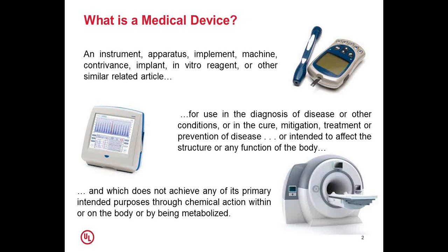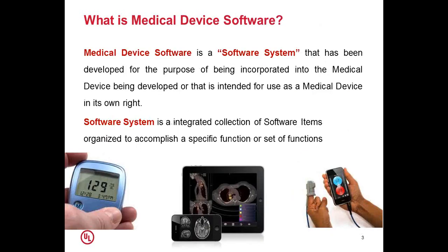So the next question comes here is medical device software. A medical device software is a software system that has been developed for the purpose of being incorporated into the medical device being developed, or that is intended for use as a medical device in its own right.